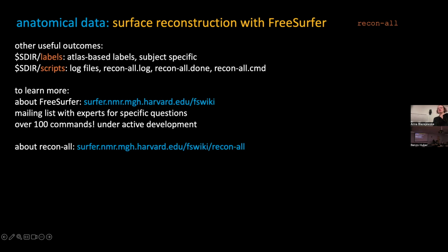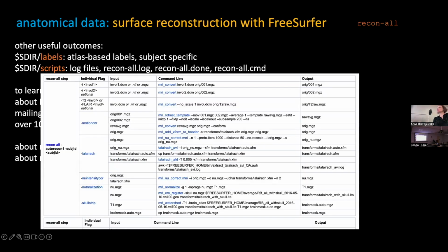There's also a recon-all page of the wiki that may be helpful tomorrow. And there's also this table that I find very useful that lists all the tools, inputs, outputs, and flags that are used in recon-all. Now, this is valid for version 7.4.